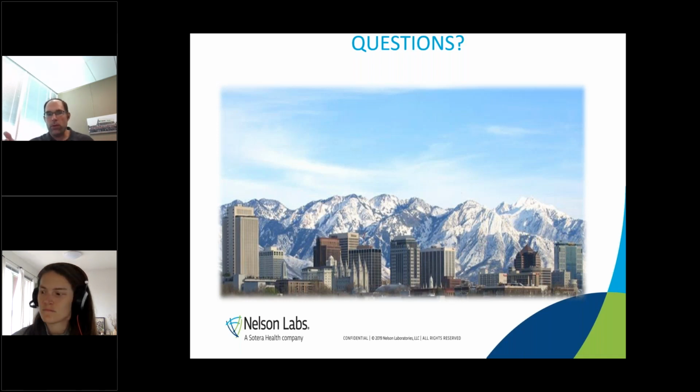A lot of 3D printed devices, even if they're classified as low risk or even class 1, because they're 3D printed, the FDA sometimes has a little bit more concern about them because the process is so new. Some of the 3D printing processes have been around longer and are more known than others, but those are things you need to consider. And then based on how the device is used, you have to go into the risk assessment for that change. Using some of those simple chemistry tests I talked about helps.